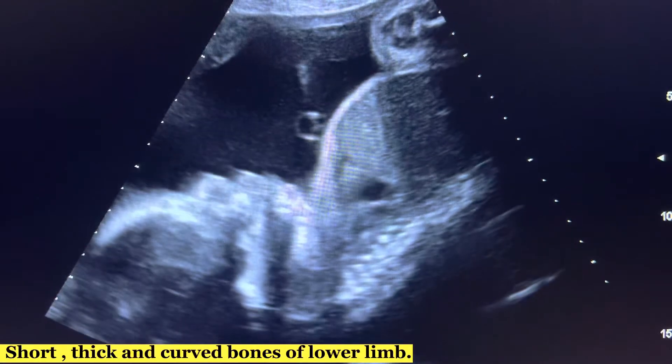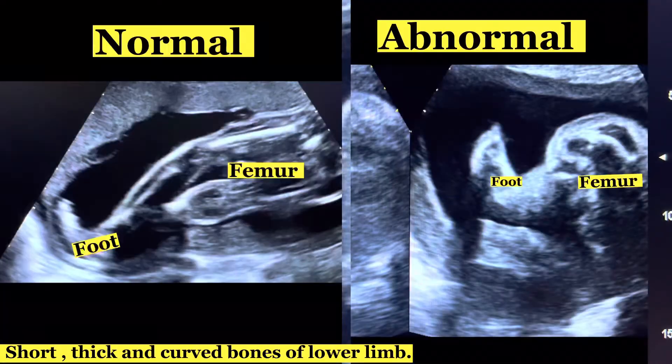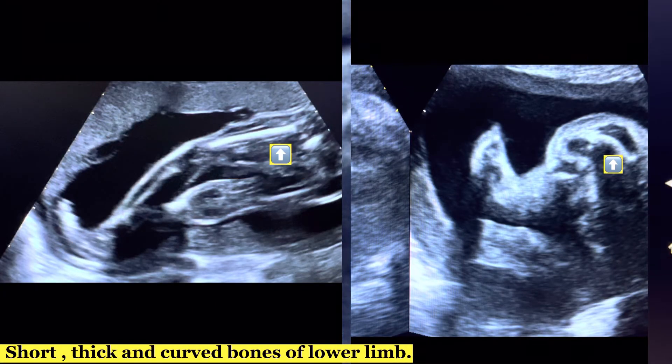Ultrasound video showing a narrow thoracic cavity, with short, thick, and curved bones of the lower limb.